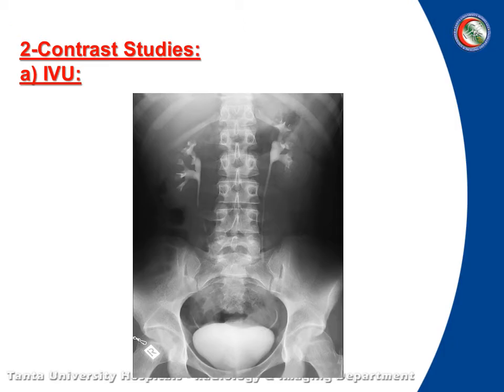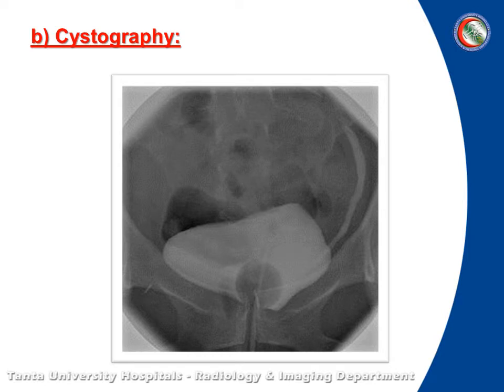In contrast studies, first with IVU, there is total opacification of both pelvicalyceal systems, both ureters, and total opacification of the urinary bladder — no filling defect, no diverticula, no strictures. In cystography, also complete opacification of the urinary bladder with no filling defect or diverticula, only the smooth rounded filling defect of the balloon.